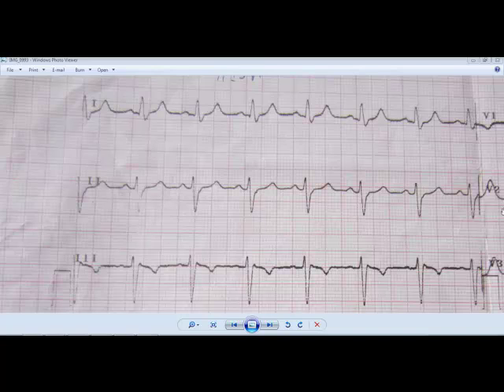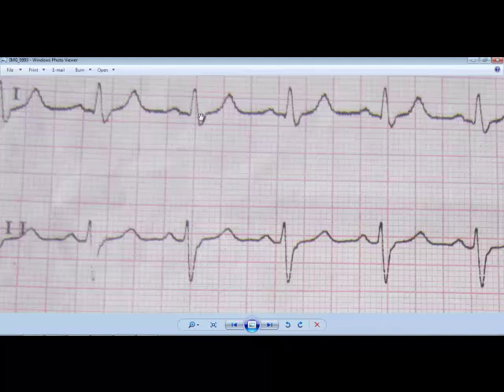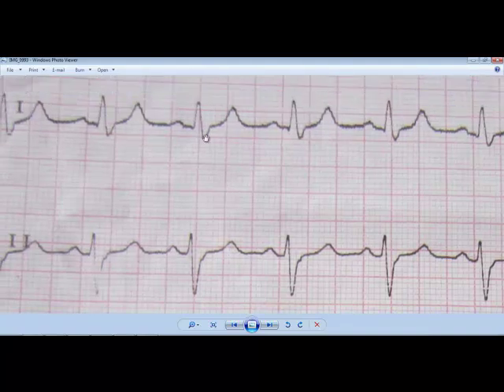Here is the ECG of the same patient which we used for right bundle branch block, and here there is one more anomaly we'll discuss. First of all, we can see there is a small S wave — the QRS, as we already mentioned in the right bundle branch block video, is more than 120ms — and there is a left axis deviation.